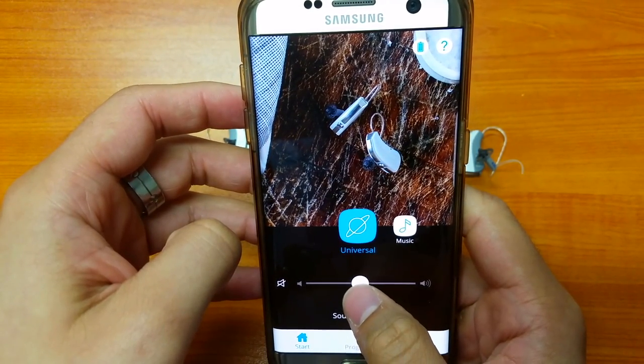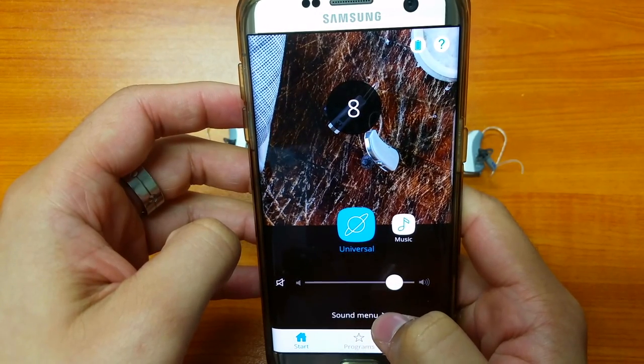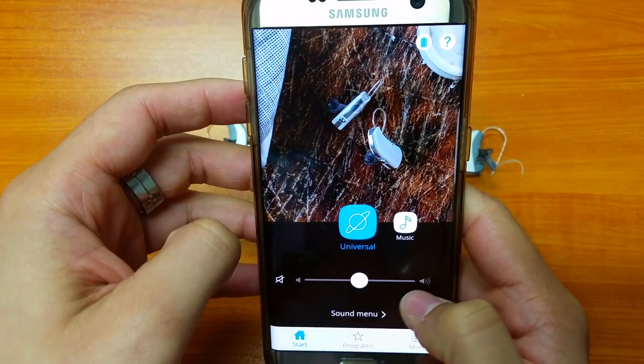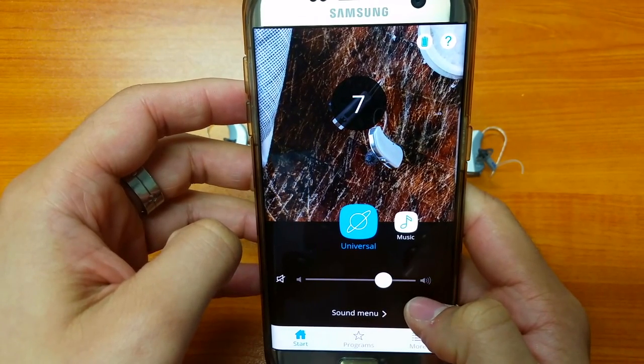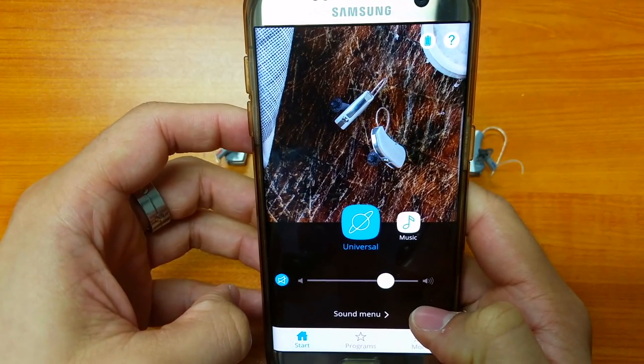Underneath we've got a volume slider. A great feature is we get a numerical value telling us where we're at, so if we want to go back to the midpoint we just bring it back down to 5. You can also tap the little speaker icon, and if you want to quickly mute the hearing aids you can select the mute function as well.